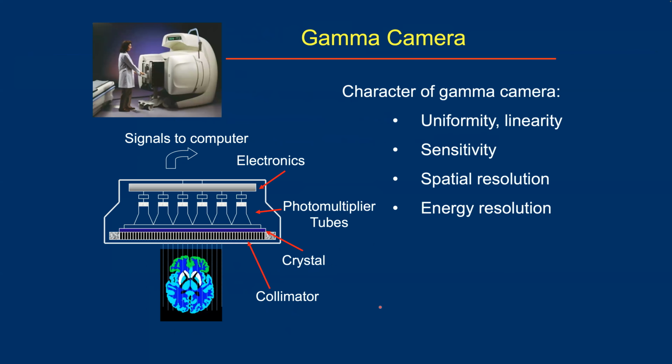So the most important part of the SPECT system is the gamma camera. As shown here, the gamma camera's first component is the collimator, which serves as a mechanical lens that filters out unwanted gamma rays. The gamma rays then reach the scintillating crystal, which converts gamma photons into visible photons, which are detected by the photomultiplier tubes behind the crystal. Then the signal is converted to an electronic signal and goes through amplification and pulse analysis to generate energy and position information used for imaging.